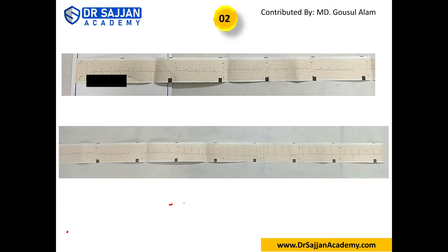P wave morphology is not so clear, but it looks normal. PR interval: we don't have a rhythm strip so we cannot comment on PR interval. ST segment: drawing a line along the baseline — looks normal in most leads. However, in AVL there is slight widening, and in AVF there appears to be slight ST elevation.